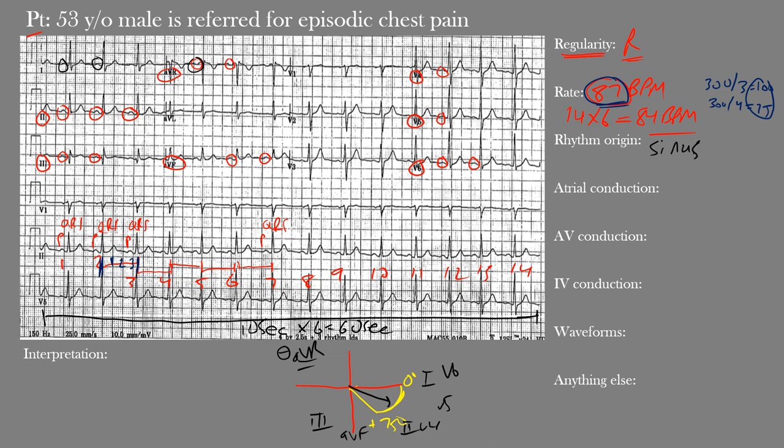For atrial conduction, we look at leads II and V1. The P waves are more evident in lead II. They appear normal, with duration within normal limits. The normal P wave duration in adults is less than 120 milliseconds, which is three small boxes. Our P waves are within normal limits — atrial conduction is normal.